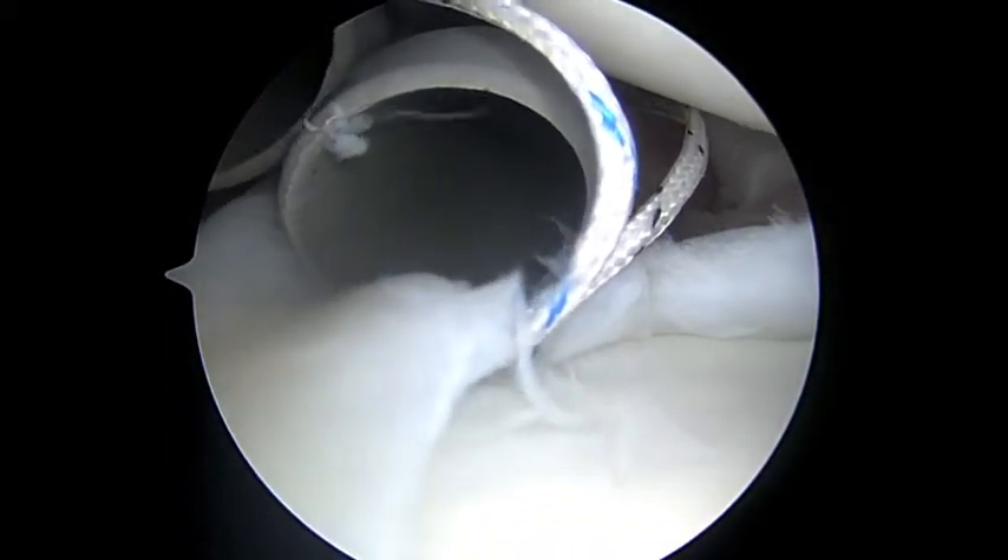That's nice and tight. Now we're going to go ahead and tie this knot. We've got two sutures tied to repair the biceps anchoring — that looks good. That looks pretty solid. You've got this meniscoid labrum here, and I'm a little concerned about the appearance. I don't want to leave something upright here — I may put another anchor down just to secure that down. We'll have a look at that in just a minute.